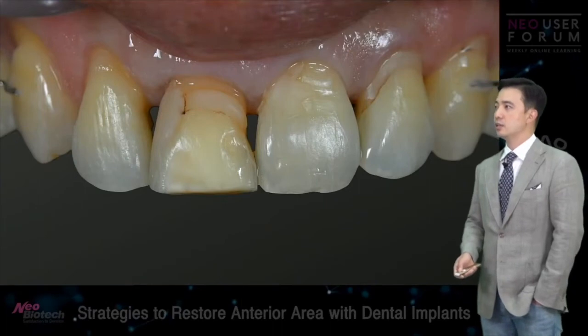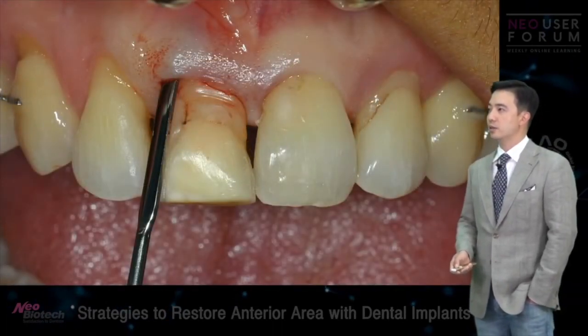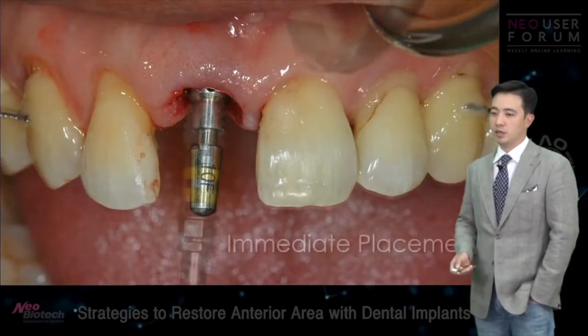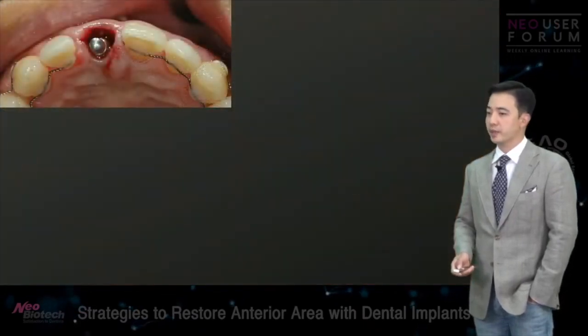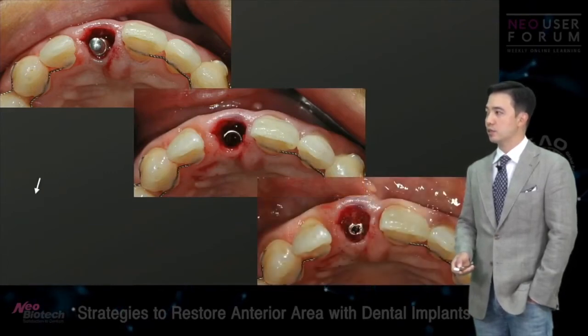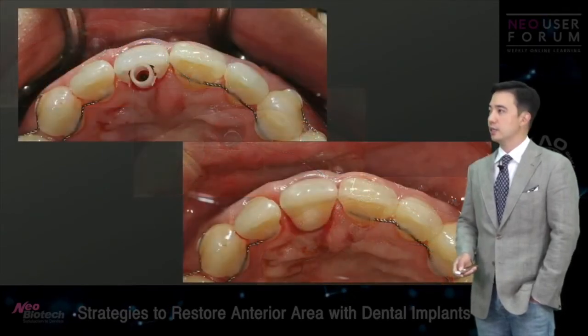So this is on the day of implant placement, extracted in a minimally invasive fashion using a periotome, immediate implant placement. Also, for this case, we did immediate provisional restorations because we had such good initial stability. So added a little bone right there.